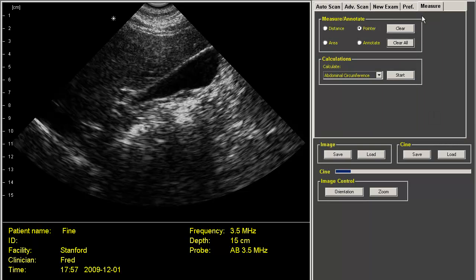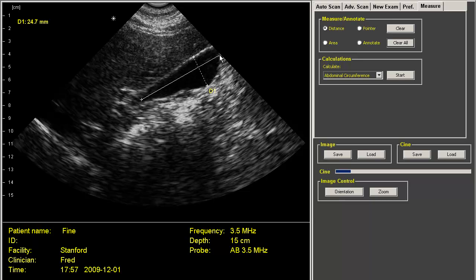The Measurement tab allows you to do simple things like distance measurement. You right-click, drag, and release to get a distance, and you can do as many of these as you like. You can also measure area, put on pointers, and annotate. And we have advanced calculation packages for OB and urology as well.